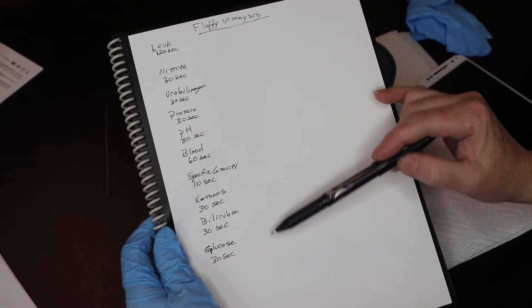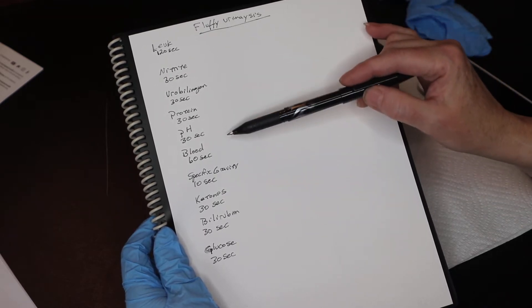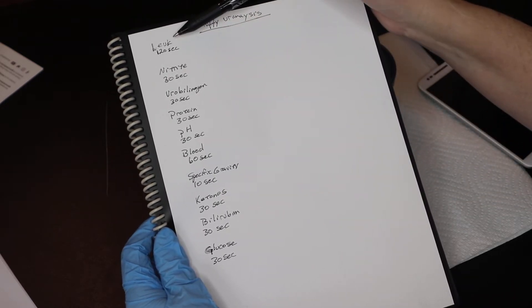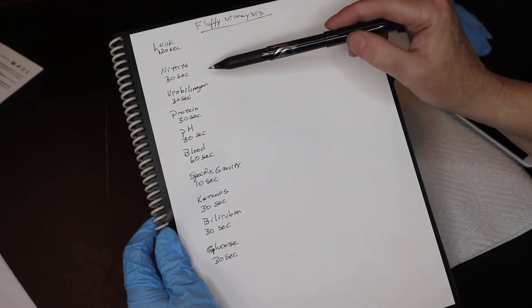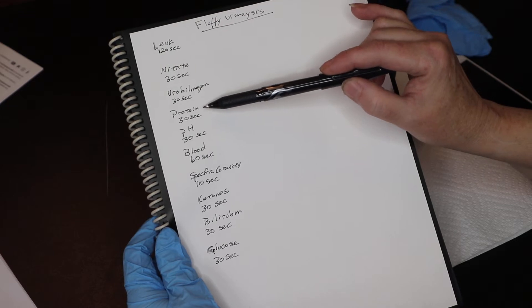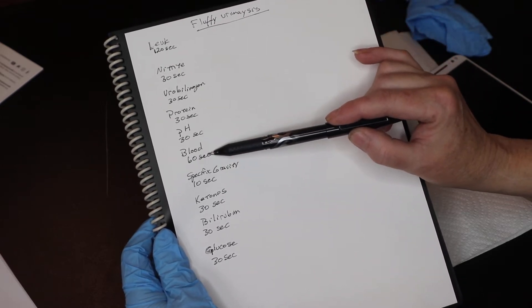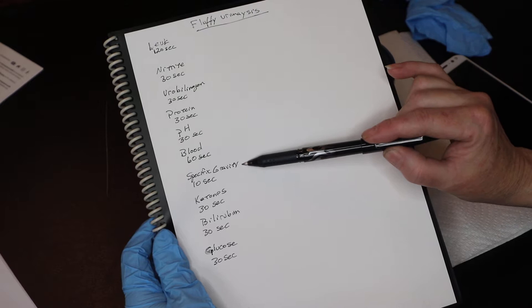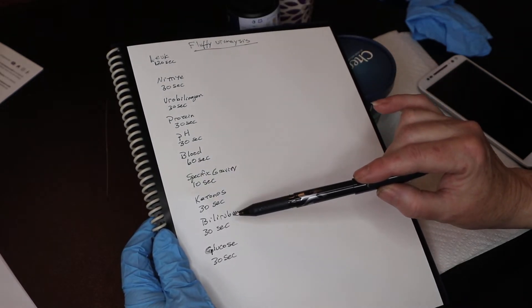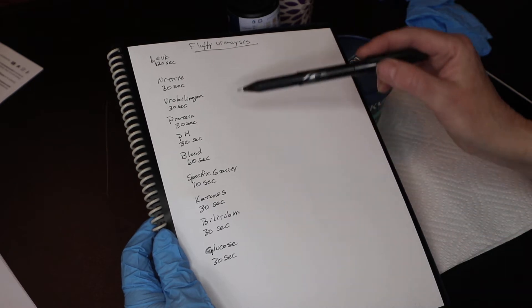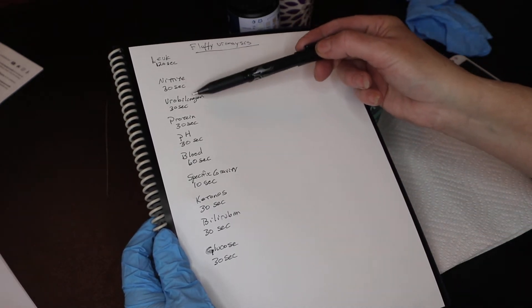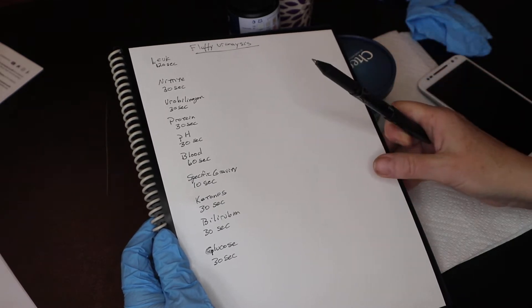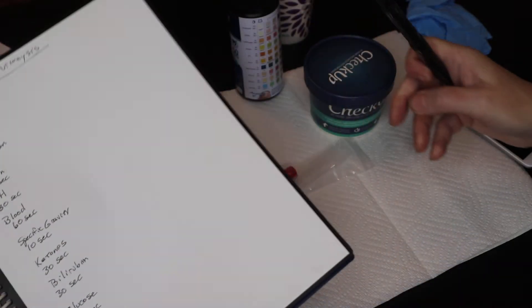We won't be dipping the whole strip into the urine and then reading the results. We will follow the 120 seconds for the leukocytes, 30 seconds for the nitrite, urobilinogen, and protein pH. Blood is 60 seconds. Specific gravity is the shortest at 10 seconds. And then ketones, bilirubin, and glucose. Some of these can be run together because they're all 30 seconds. So keep that in mind. You can shorten up that time frame.